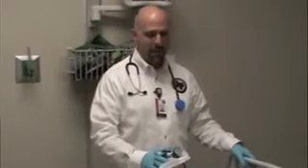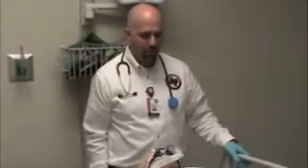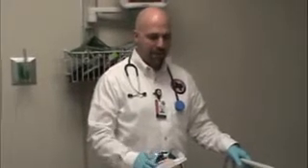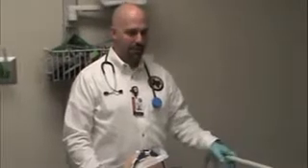So if a patient is hypotensive or they're really, really tachycardic, chances are you're going to make them worse by aggressively giving them high doses of narcotics or paralytics. If you have a patient that's chemically paralyzed, you definitely want to make sure that you are monitoring their end-tidal CO2 so that if they're not receiving a breath, you can catch that they're not ventilating well.